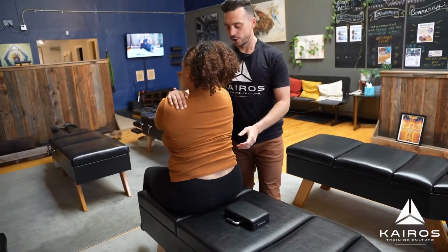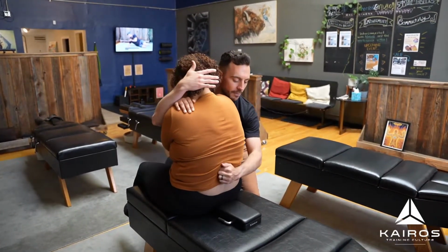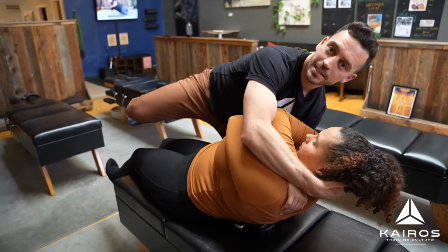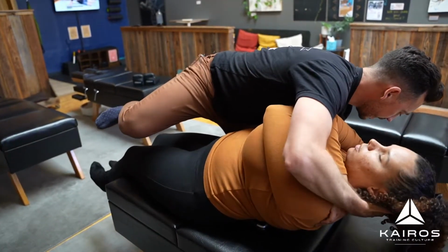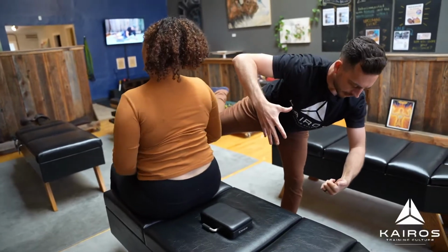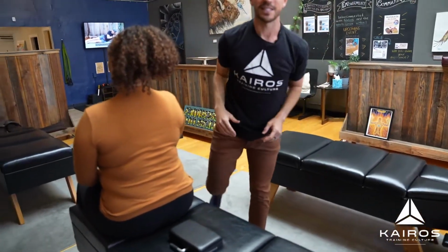Just to show you that adjustment again, because it's really tricky what I was doing with my body right there. Coming down here, fulcrum, extension, and then I like to bring this leg up to get my center of mass over her and to keep my spine nice and neutral. And then I would adjust this way. So if I were to show you that, I'm here and that way. And so it's a whole drop, and you can see the single leg balance.